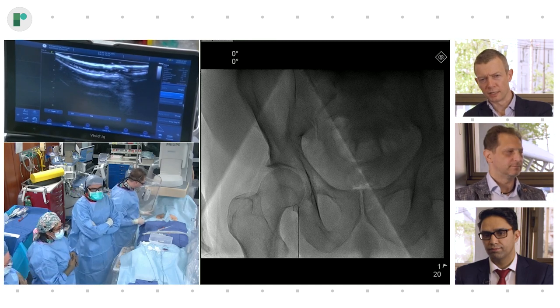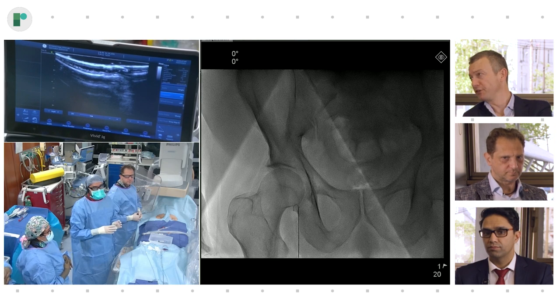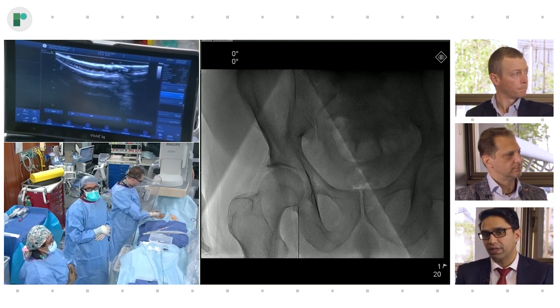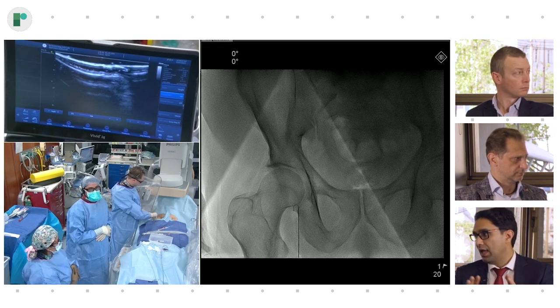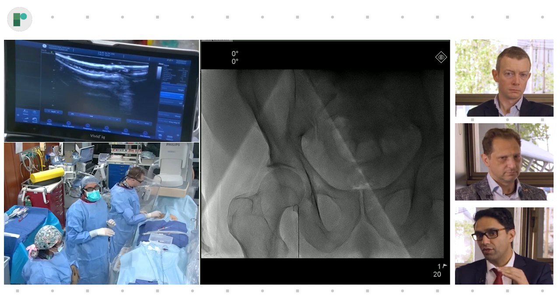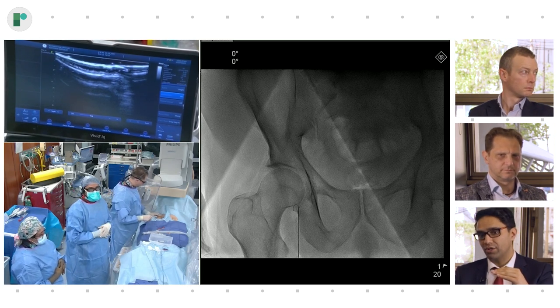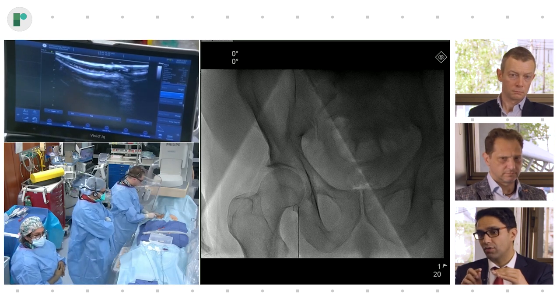So why do you do that? One of the key purposes of the ultrasound is to know where the bifurcation is. That's exactly right. It's a great point, Joost, because this should be done with a combination of fluoroscopy and ultrasound. The ultrasound is really used to determine where the bifurcation is, so we don't stick underneath it. But then, once we've identified that spot, usually with some forceps, we perform fluoroscopic guided entry into the artery wall.